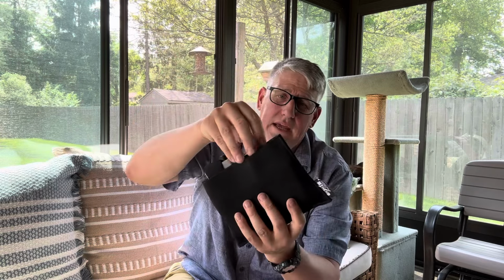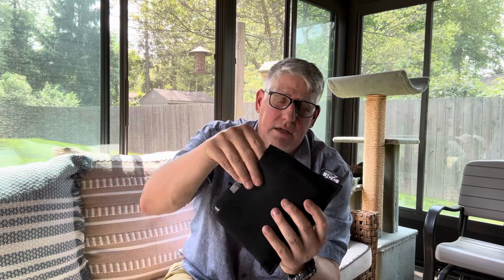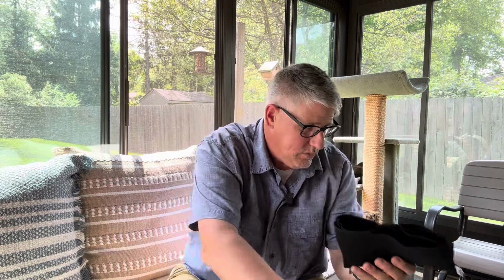I have, again, my chest seals. In this one I carry, again, an S-Mark bandage, that's from TacMed Solutions, and then another compressed gauze. And then my CAT tourniquet flat packed as well. So that would be my day-to-day kit that would be inside the waistband.